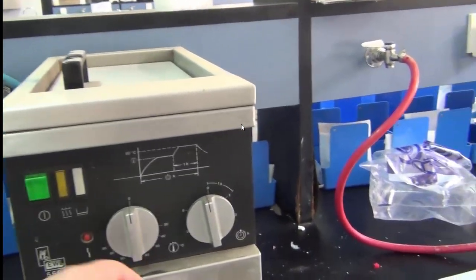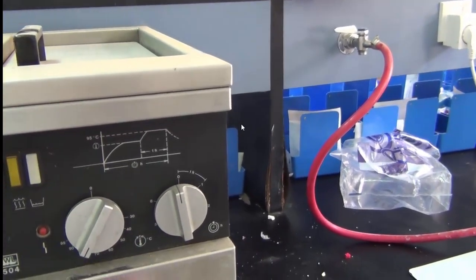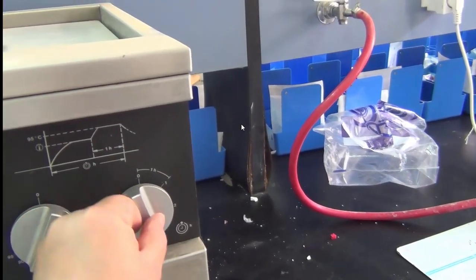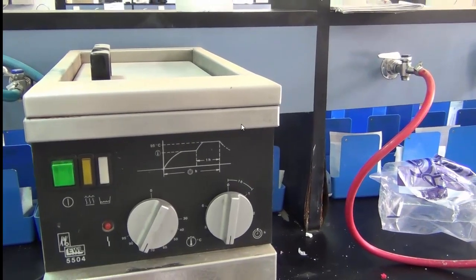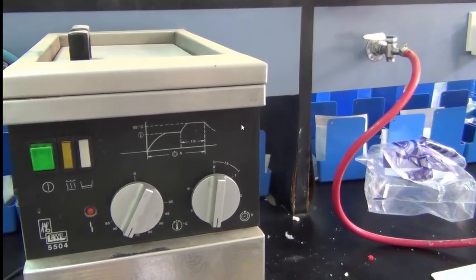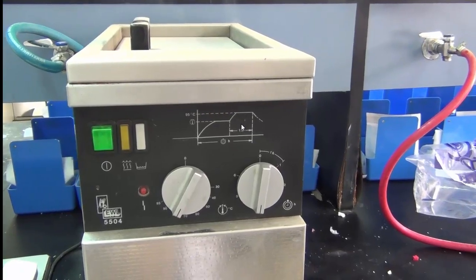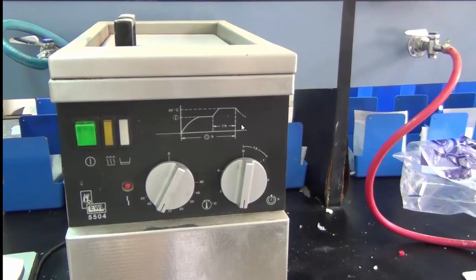So the temperatures are set, for example, in this cycle, and we set the time. For example, for this cycle might be 3 hours, 5 hours, depending on the manufacturer instructions, and we leave it, and it will automatically do the cycle. When the time finishes, the acrylic should be cured, and we call this the curing of the acrylic. It's heat curing of the acrylic.